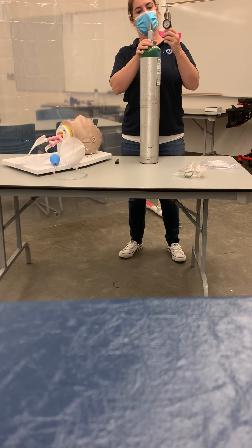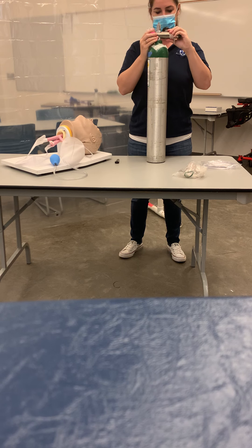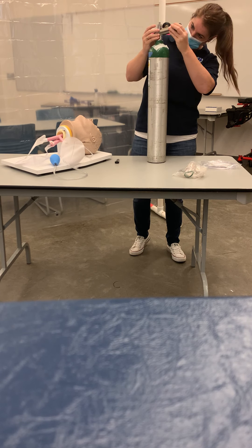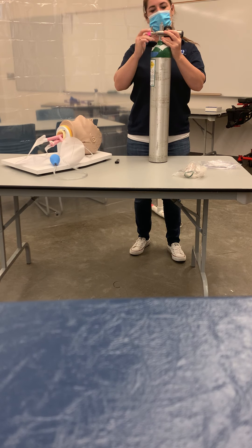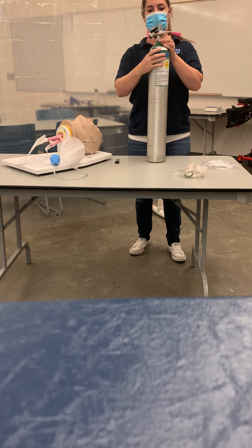On your regulator you also have prongs — these prongs fit directly onto your O2 tank. Another important thing to know about your oxygen tank: you'll never want to stand it up unsecured. If it falls, it can actually become a projectile. So if you are going to stand it up, you need to be holding it. If you're not near it, it always needs to be laying down or secured.